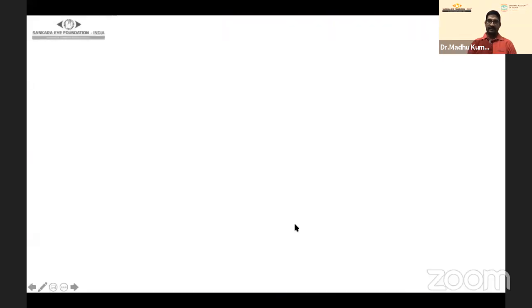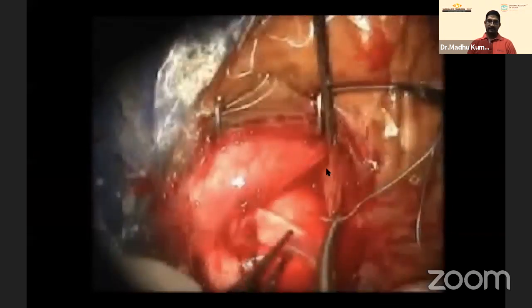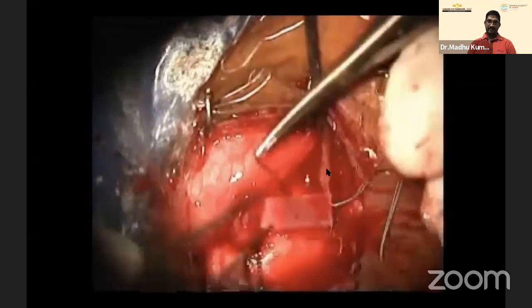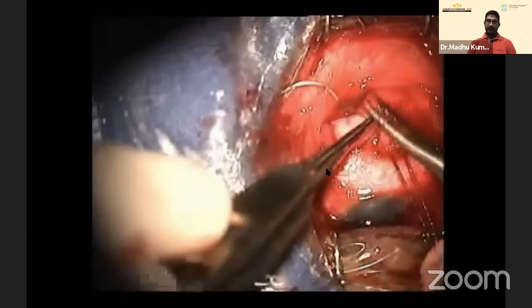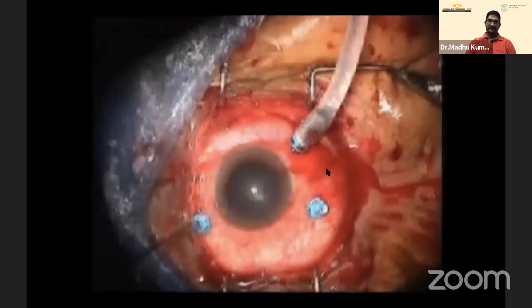Rather than doing extensive surgery like disinserting the inferior rectus, we placed a small piece of 240 band to support the tear, as suturing there was also difficult due to limited accessibility. We then went ahead with the vitrectomy.